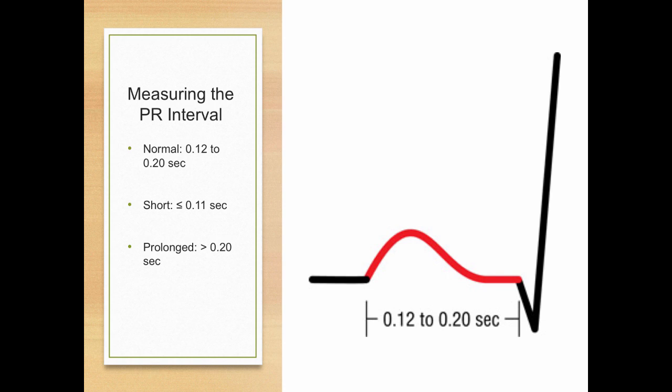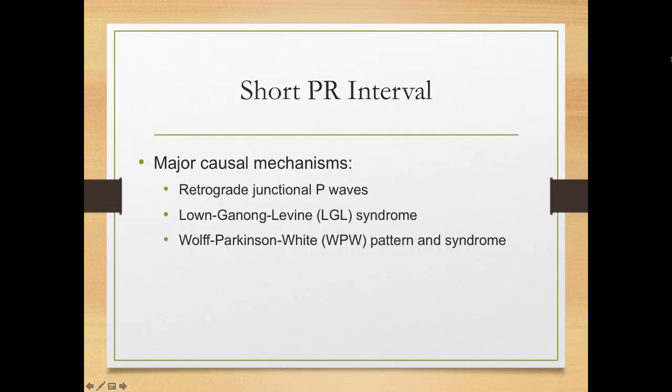What if you have a short PR interval? That's weird. That's uncommon. That's abnormal, right? So it's shorter than 0.12 seconds.